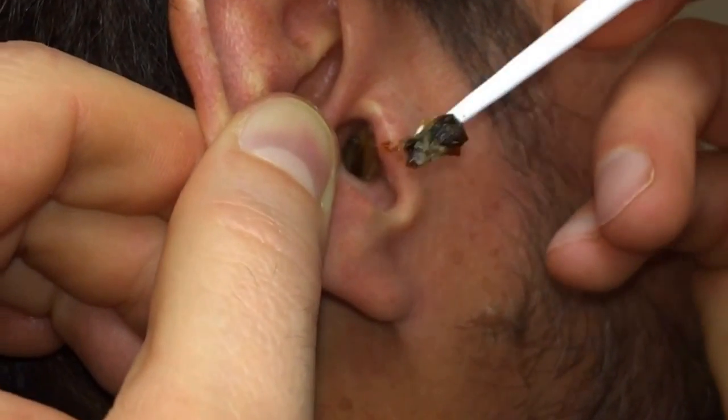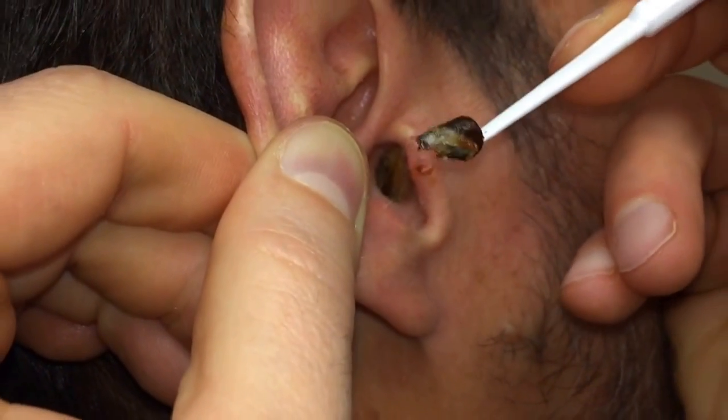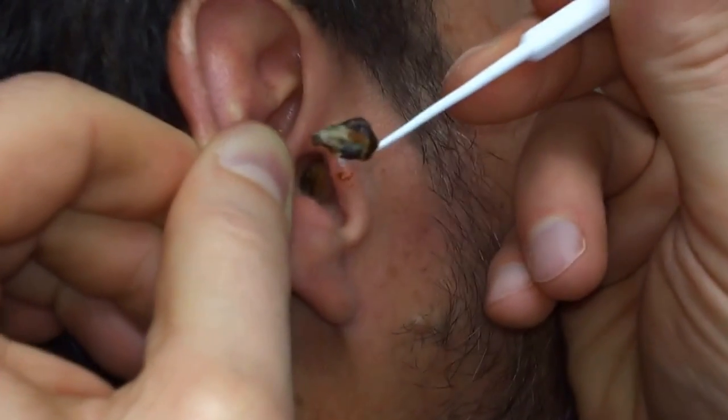And let me look in the canal. Okay, I'm going to get the tool to look in the canal.